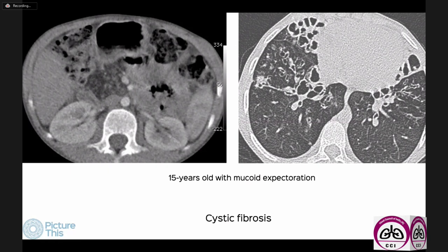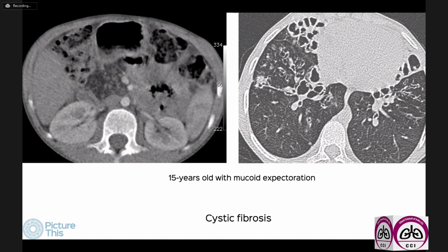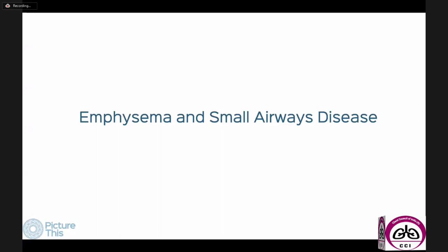As far as bronchiectasis is concerned, it's an easy diagnosis to make, and once made, as radiologists we try to identify an etiology. Most of the time we don't find a definitive etiology because the commonest causes are viral infection in childhood or tuberculosis. But in other instances, sometimes we can make an etiologic diagnosis.